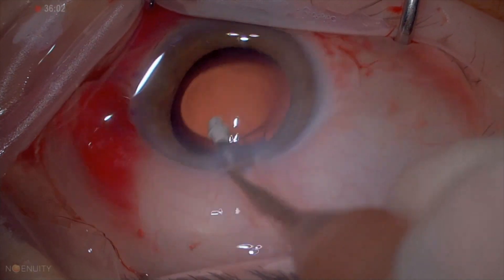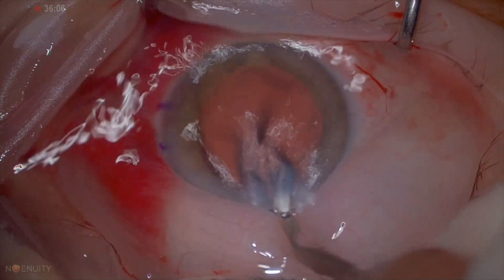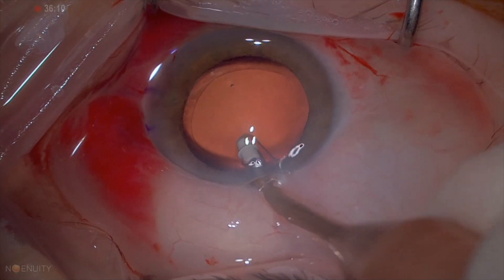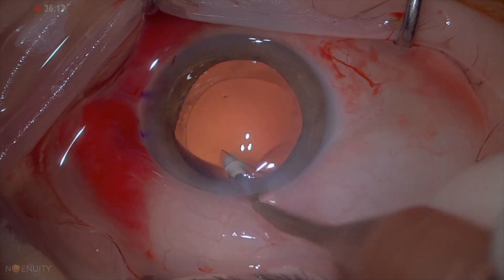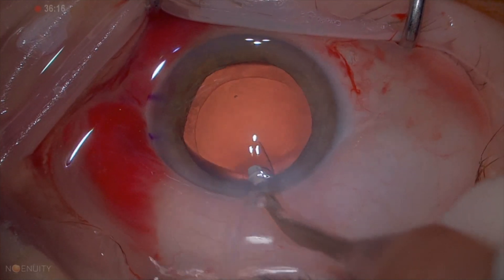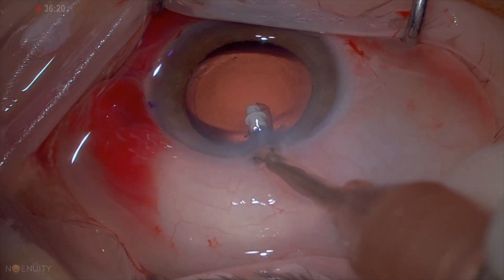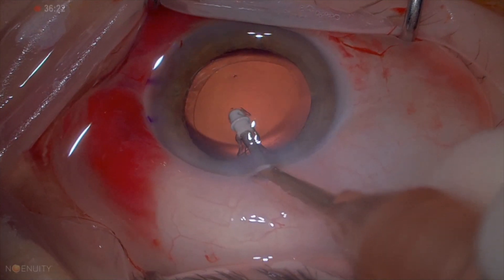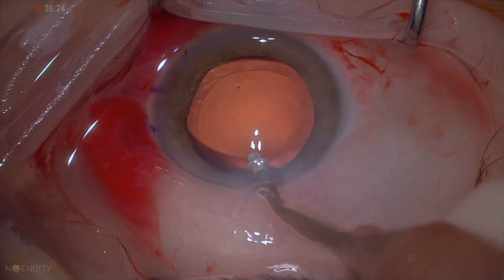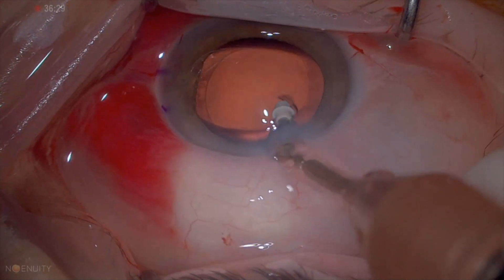You can see here also something floating around. Is that a Descemet's membrane detachment or a remnant of the anterior capsule? The senior surgeon felt that it was only an anterior capsular remnant that was there and was not removed after the capsulorhexis. And that ended up to be the case. Thank you so much for watching.